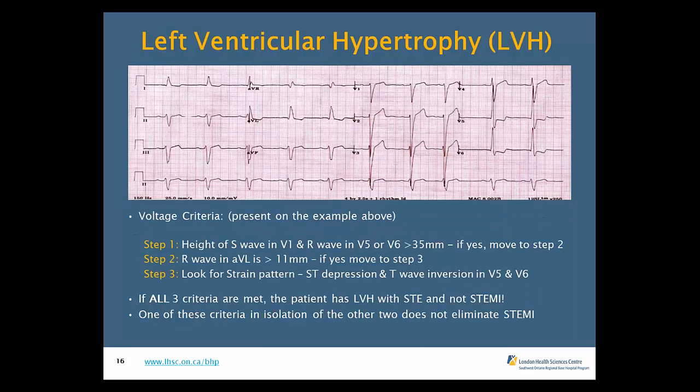Matt, how do you feel about walking us through this one? There are many different ways of calculating LVH. There are many different formulas out there. The expectation is that you don't know each and every one of these formulas. Again, it's a bit of pattern recognition as well. Some simple things to look for in LVH are described through step 1, step 2, and step 3.